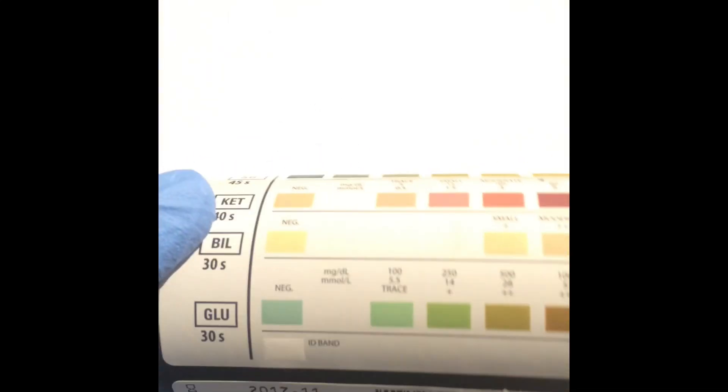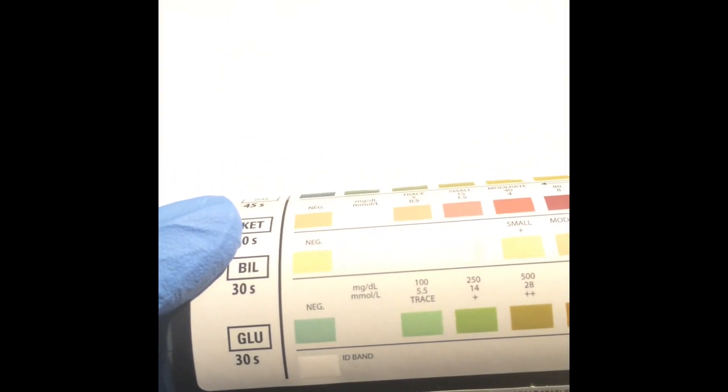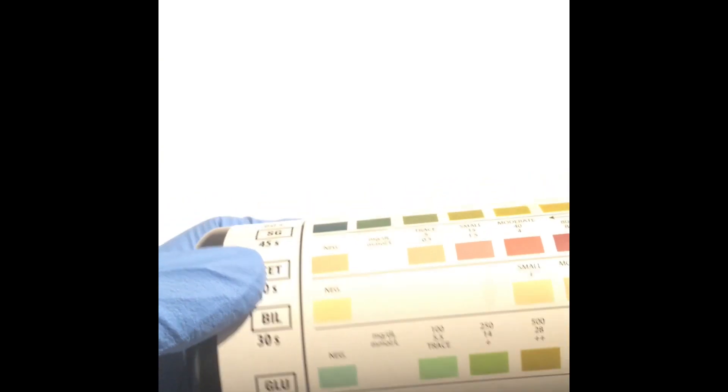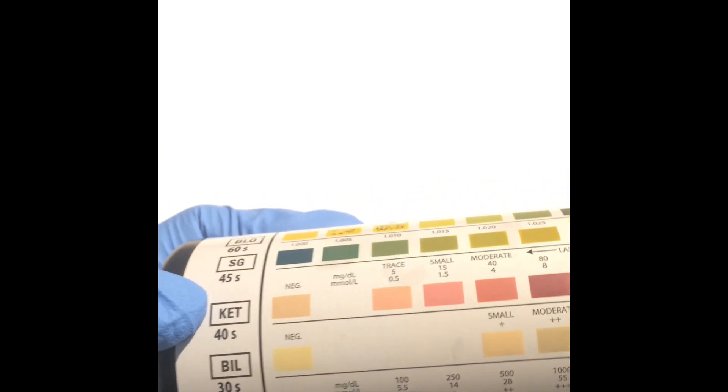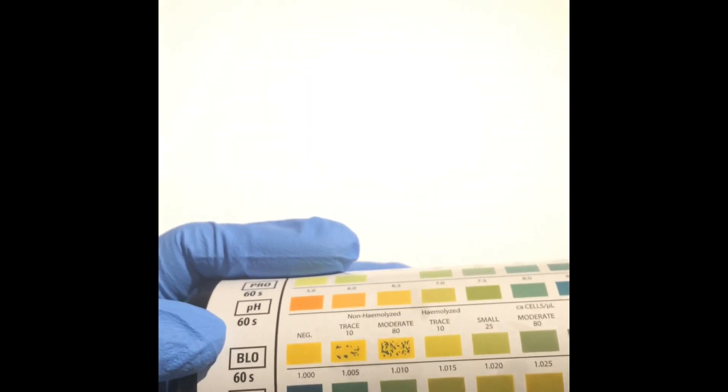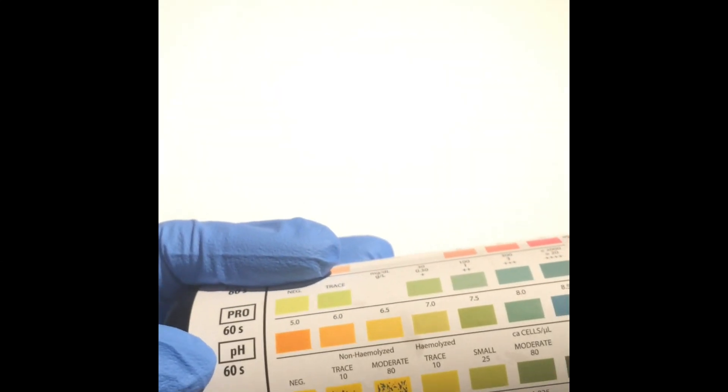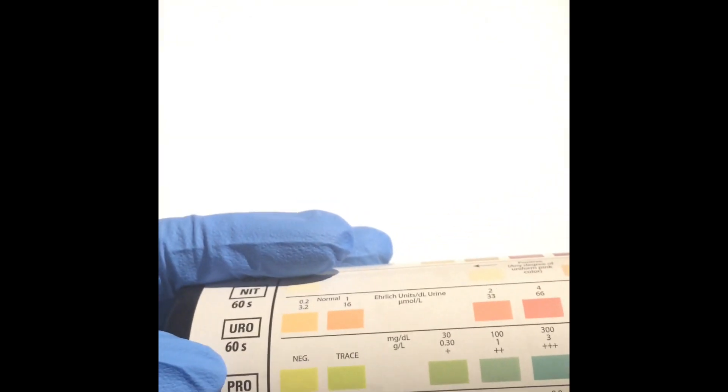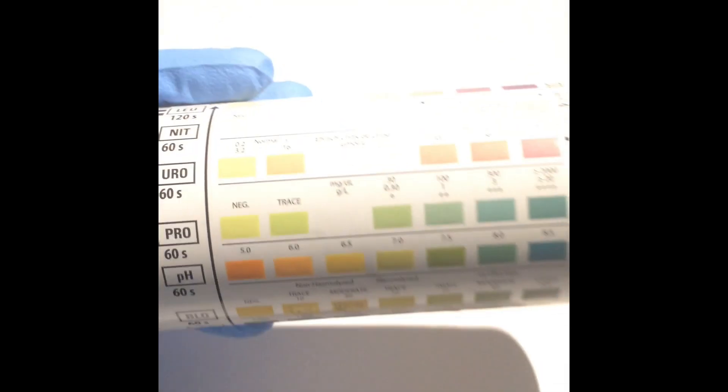Looking at the side of the bottle are the various colors that can be seen on the dipstick. Each parameter has a specific time to be read. For example, 30 seconds, 60 seconds, 120 seconds, etc. So don't forget to keep a stopwatch if you're doing this test manually.